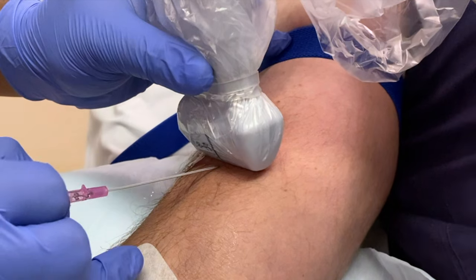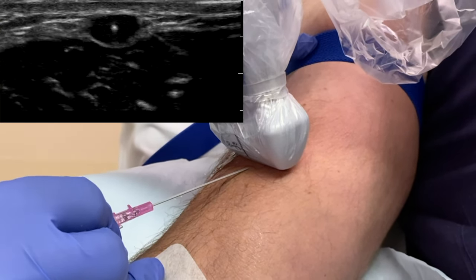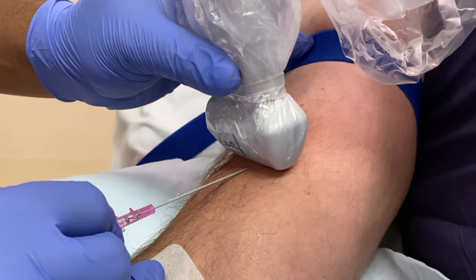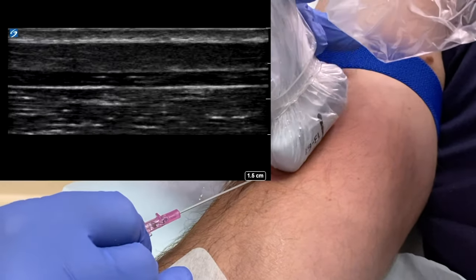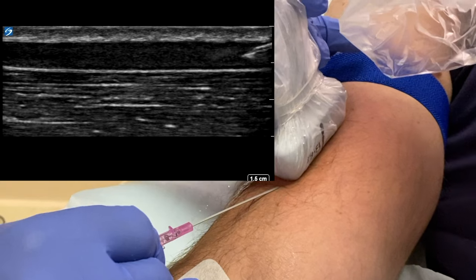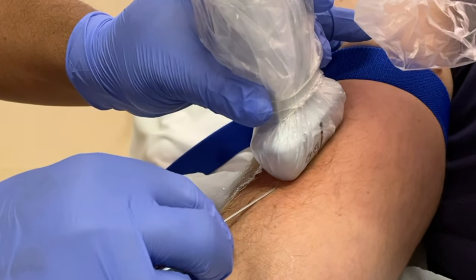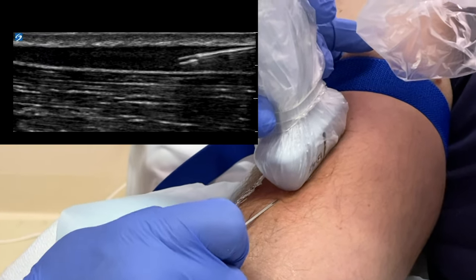Combining a transverse and longitudinal approach will improve your success rate. Wipe and insert the cannula through gel-free skin. Insert the needle in transverse view until you can visualize the needle tip. Slide the probe up to view the advancing tip. Turn the probe to a longitudinal view and confirm placement. Once satisfied, deploy the cannula over the needle and continue the procedure as normal.